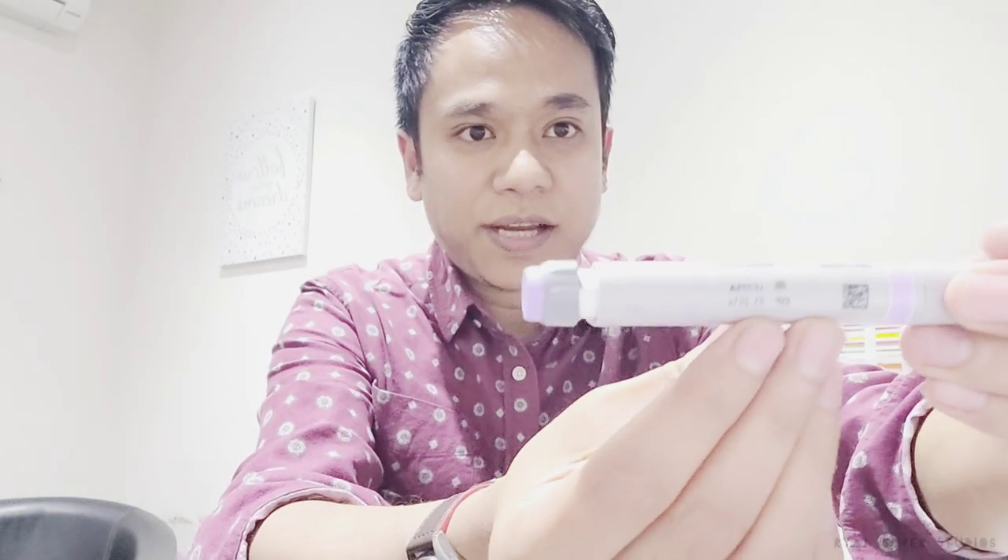There's also a manufacturer date and an expiry date on the pen. You need to make sure you check the expiry date, because sometimes pharmacies will give you an expired one — they forget to restock their insulin. So always check that it is not expired.